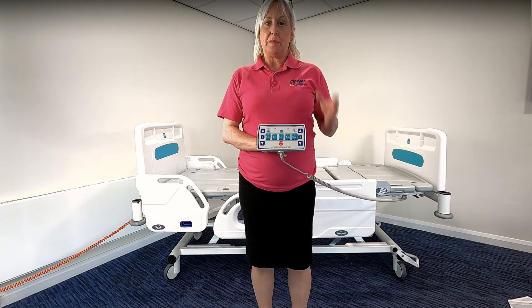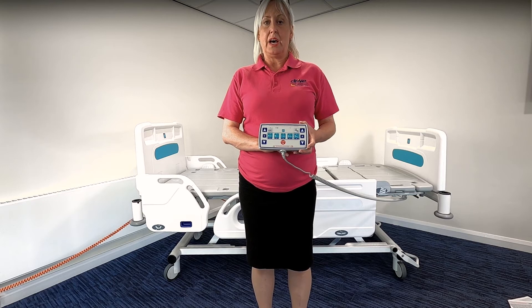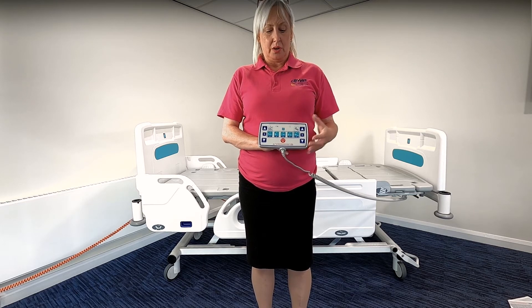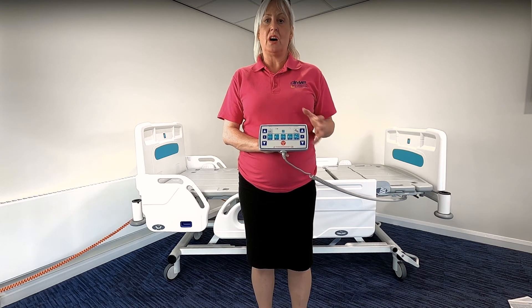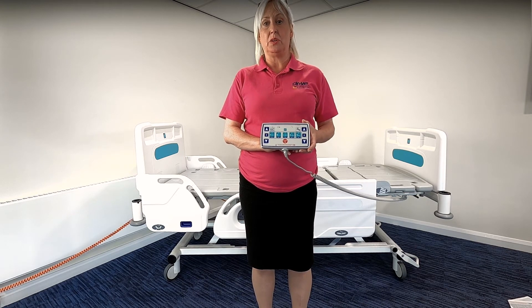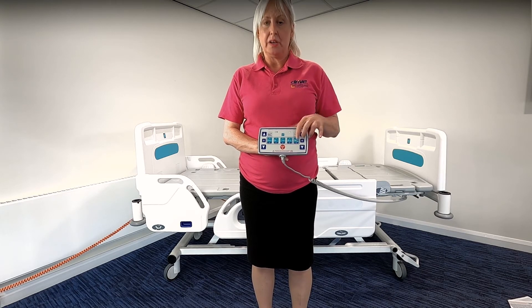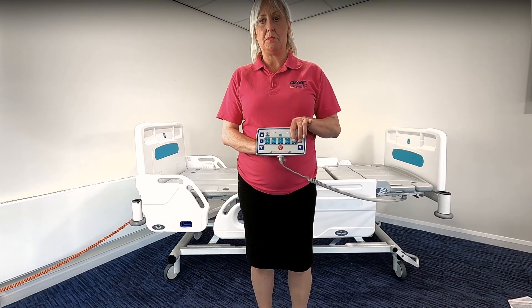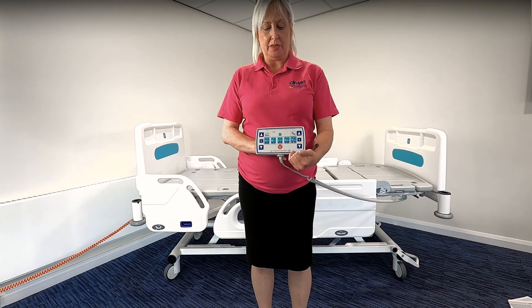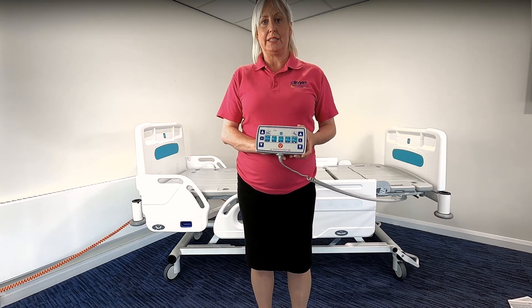Because the patient handset or the side rail function has patient control, there is an ability within the nurse handset to lock out any functions that are not safe for that individual in the bed to utilise. To lock out a function you simply press the lock button and the function button together — so to lock out the head and foot-down tilt, you would simply press these two together and the lock button will indicate that it's locked out on the patient handset.